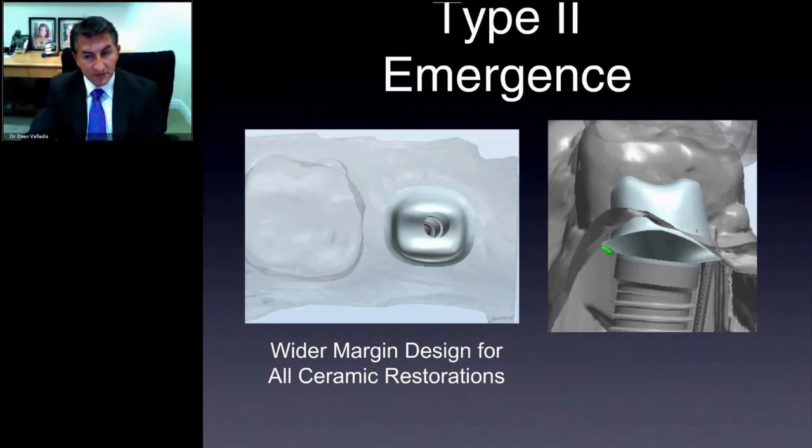By looking at the designs, we can now look at it and say, well, is this tissue going to be pushed out as that angle comes on an obtuse level? We figured out there's a formula for that. I'm going to show you that in a little bit. But making sure that we're looking at our designs as clinicians is going to help out the final result.